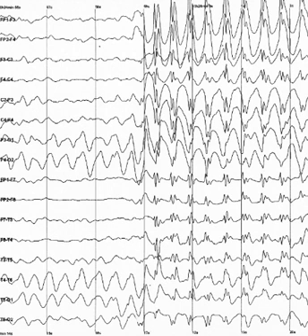Frequency bands are usually extracted using spectral methods, for instance Welch, as implemented for instance in freely available EEG software such as EEGLAB or the Neurophysiological Biomarker Toolbox. Computational processing of the EEG is often named quantitative electroencephalography (QEEG). Most of the cerebral signal observed in the scalp EEG falls in the range of 1 to 20 Hz. Activity below or above this range is likely to be artifactual, under standard clinical recording techniques.